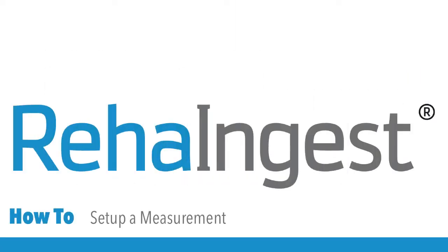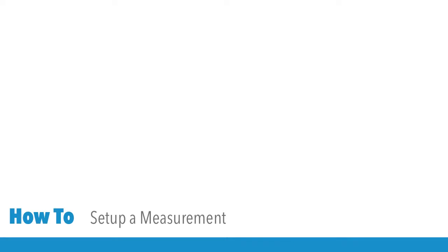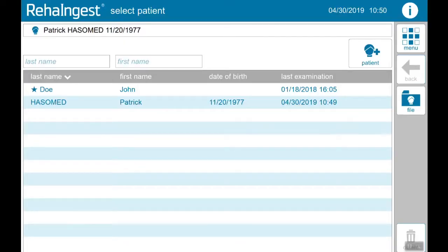Welcome! In this video you will learn how to set up a measurement and how to record and save it.